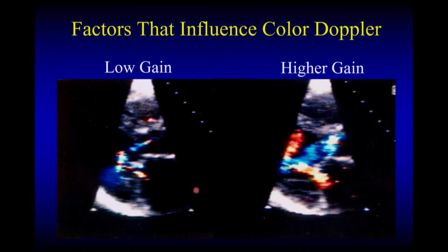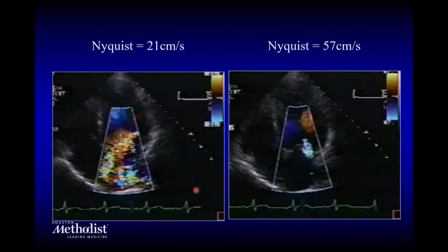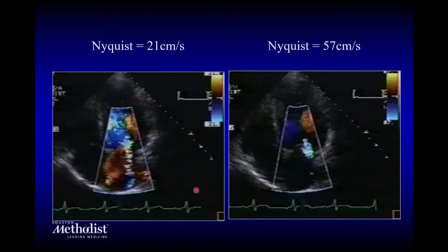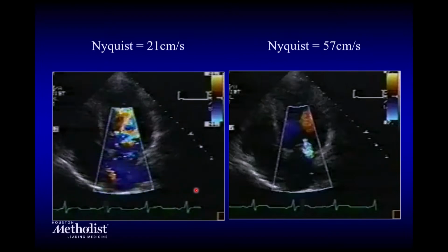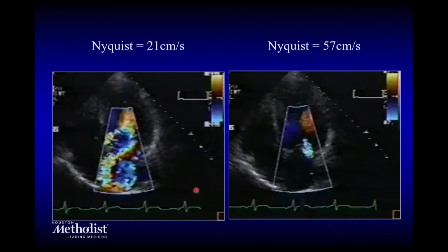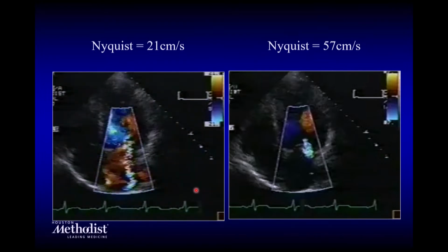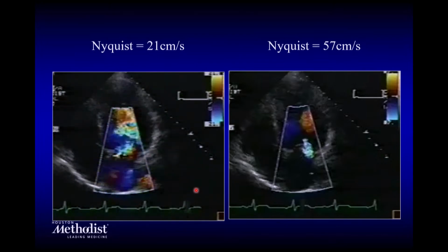The aortic regurg looks quite impressive, and this is real. I was called to the operating room in the days where we used to man the operating room. You're not manning the operating room, where Dr. Lowry starts a case at 7 o'clock at night and wants to finish at 11. No, but in truth, I was called because a color Doppler was done in the operating room, and the mitral regurgitation looked very impressive.